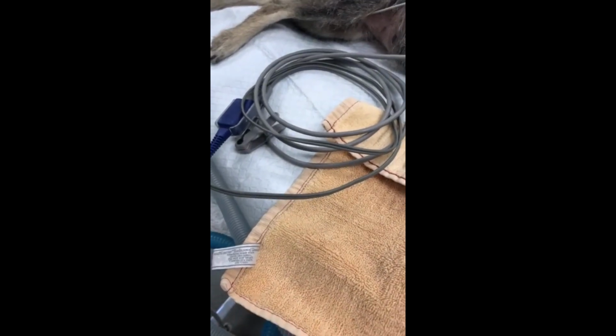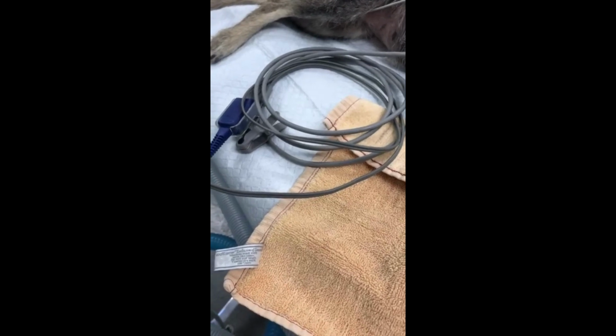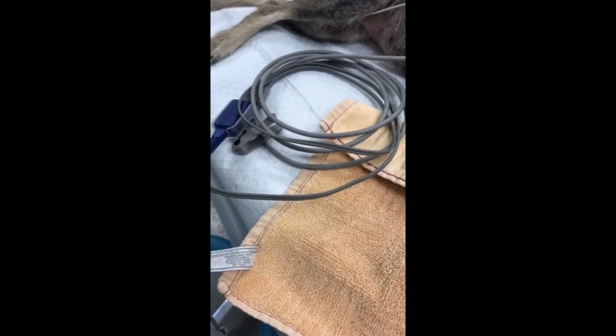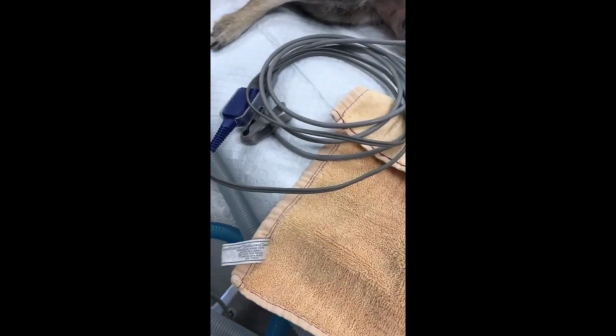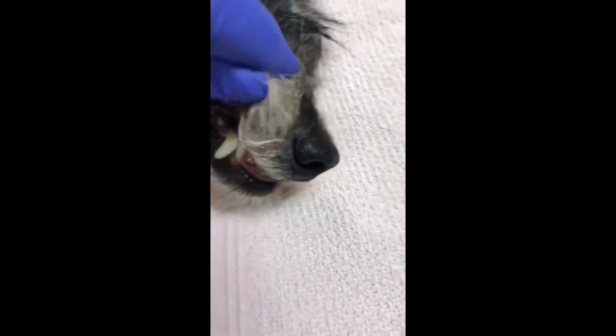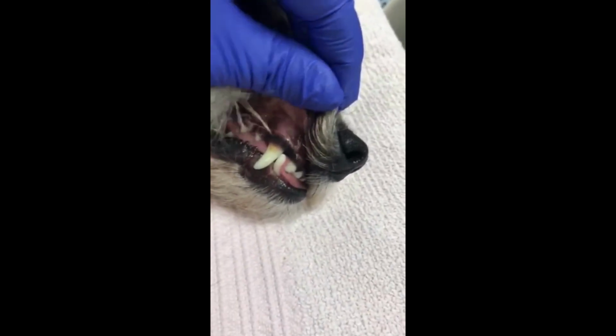When measuring SpO2, we are measuring the oxygen concentration in the peripheral bloodstream that allows us to get an idea of how well that pet is oxygenating. There are multiple places in which we can attach the SpO2. One is on the mucous membrane, on the upper or lower lip.